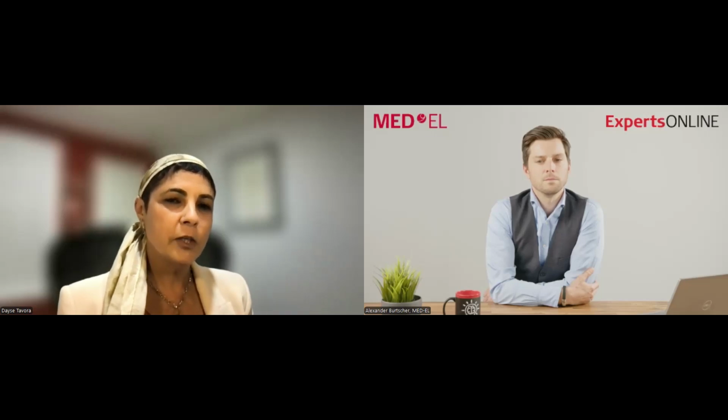If there is no change on the sound processor, then we make adjustments based on what the patient is telling us, and then we send it over. He tries, she tries, and it then is live. So within 2 or 3 minutes, whatever is needed, they tell us if it is an improvement. If it is not, we modify it again, and we keep doing this during the session. So it is not a really live measurement of the MCLs, if that is your question.